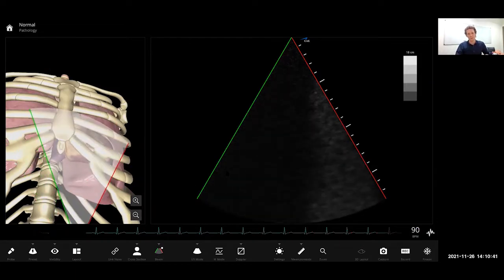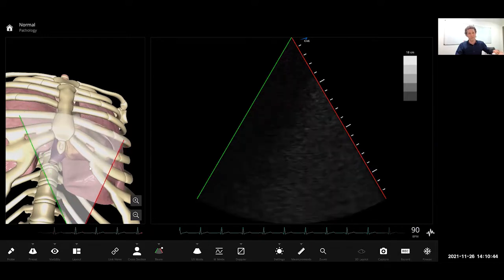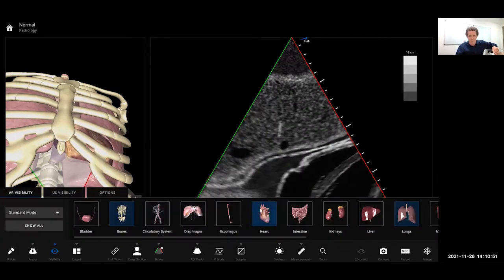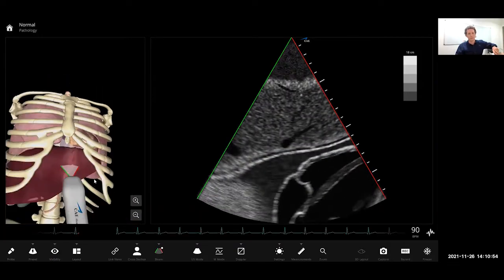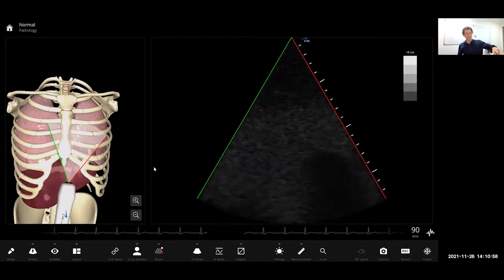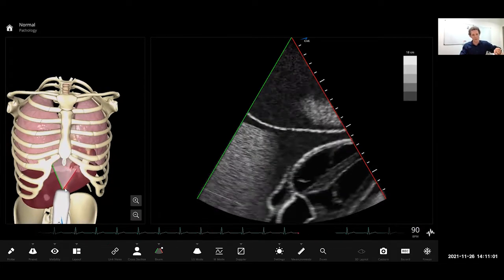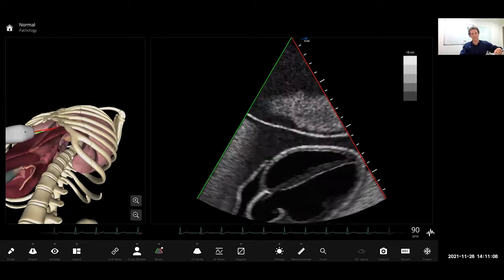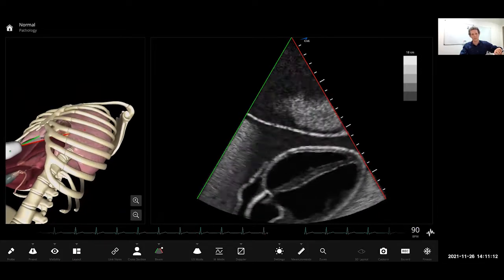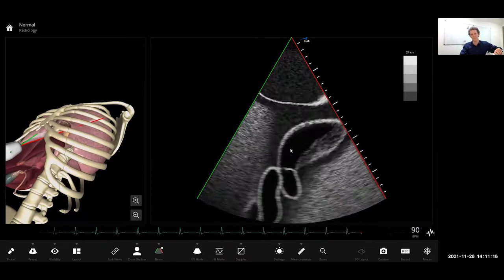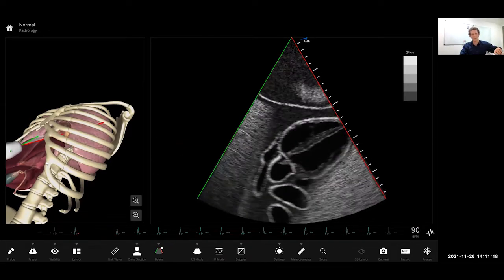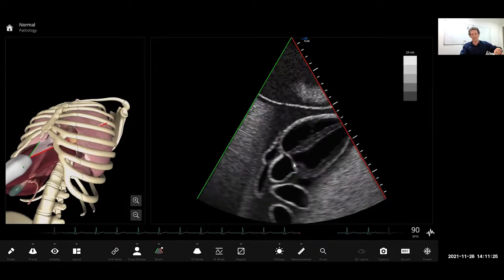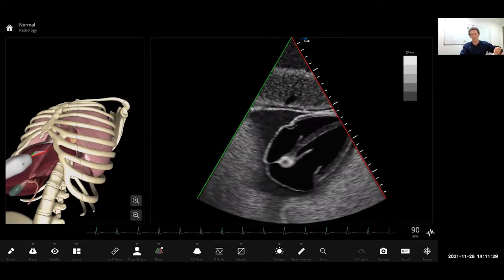Let's talk about the subcostal view — this is one of my favourites. There's a bit of stuff going around on Twitter about the utility of this so I'm clearly not the only person who loves it. For subcostal imaging we're sitting just below the xiphisternum, angling our line of interrogation up into the heart. One of the most common mistakes when doing subcostal imaging is aiming too anteriorly — if you can see the aortic valve you've aimed too far anteriorly; fan backwards until you lose it.